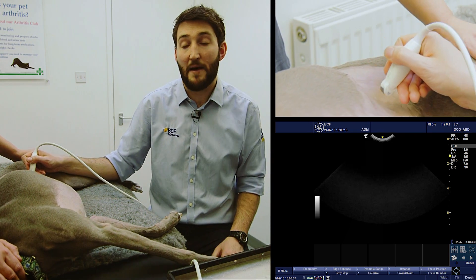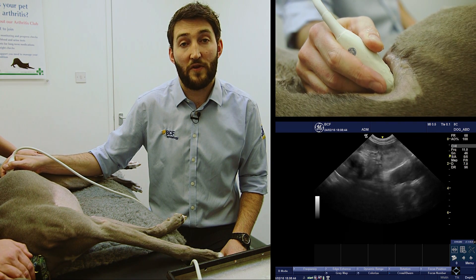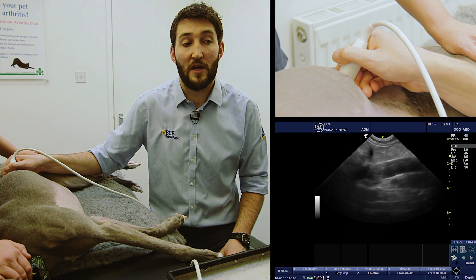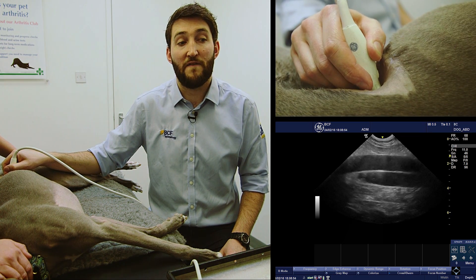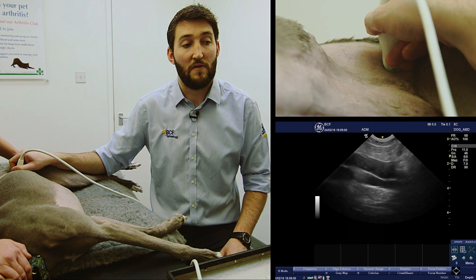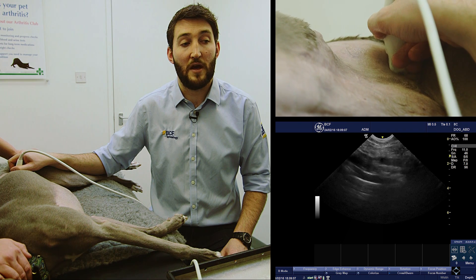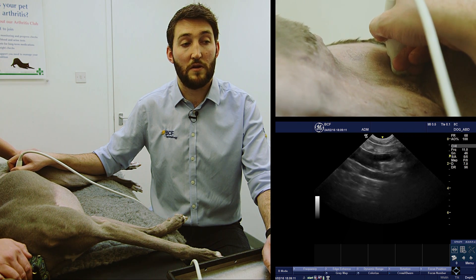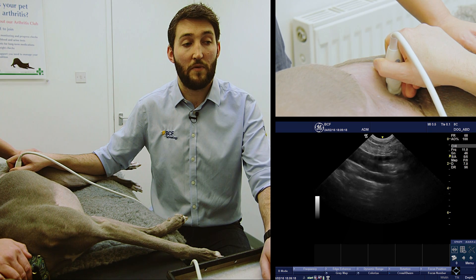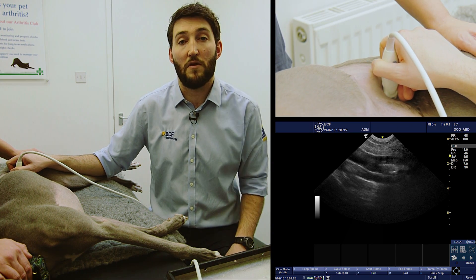As a recap: we start in the longitudinal plane, find our left kidney as before, fan dorsally off the dorsal border of the left kidney, then fan back gently and slowly ventrally until we find the aorta, then the vena cava below it. We follow those vessels caudally, making minor adjustments so we don't lose them, and once we reach the bifurcation, minor fanning movements up and down should, with a little patience, allow us to locate the lymph nodes. We've got a decent view of them here and can just make those lymph nodes out.